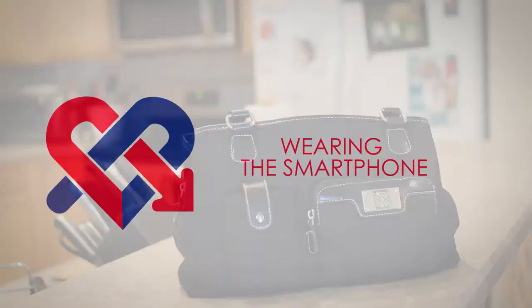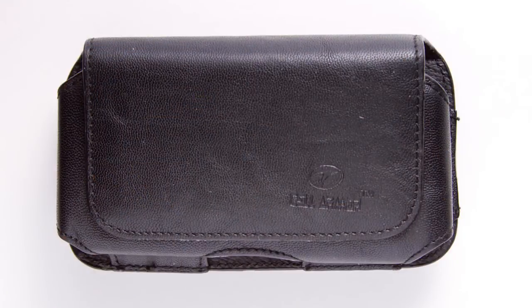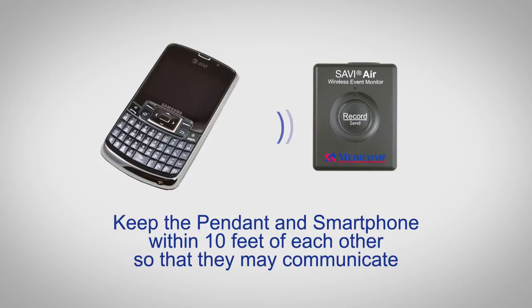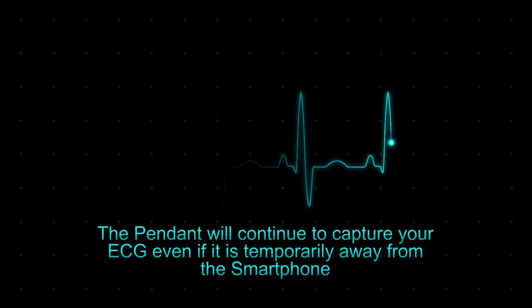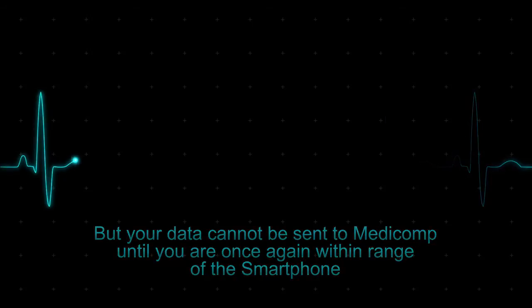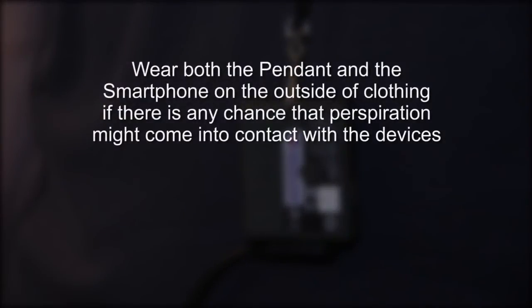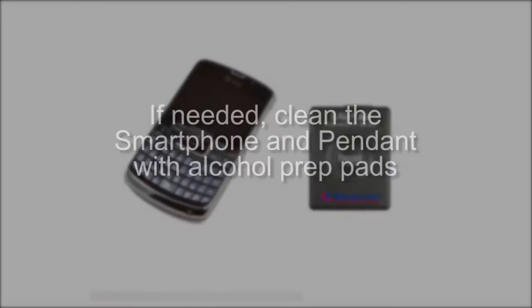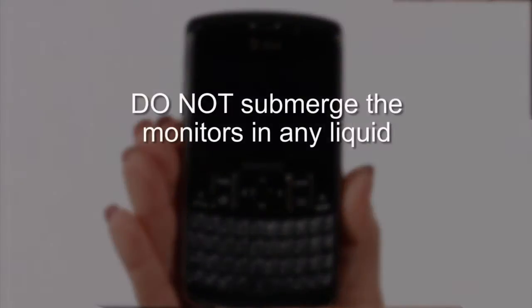Wearing the smartphone. The MediComp smartphone may be kept in a pocket or purse, or you may clip it to your belt or clothing using the belt clip case included in your monitor kit. It is not necessary to always keep the smartphone on your person, but keep the pendant and smartphone within 10 feet of each other so that they may communicate. The pendant will continue to capture your ECG even if temporarily away from the smartphone, but your data cannot be sent to MediComp until you are once again within range. Both the pendant and smartphone should be worn outside your clothing if there is any chance that perspiration may come in contact with the devices, and should be protected during wet or cold weather. If needed, clean the smartphone and pendant with alcohol prep pads or a soft cloth slightly moistened with isopropyl alcohol. Do not submerge the monitors in any liquid.